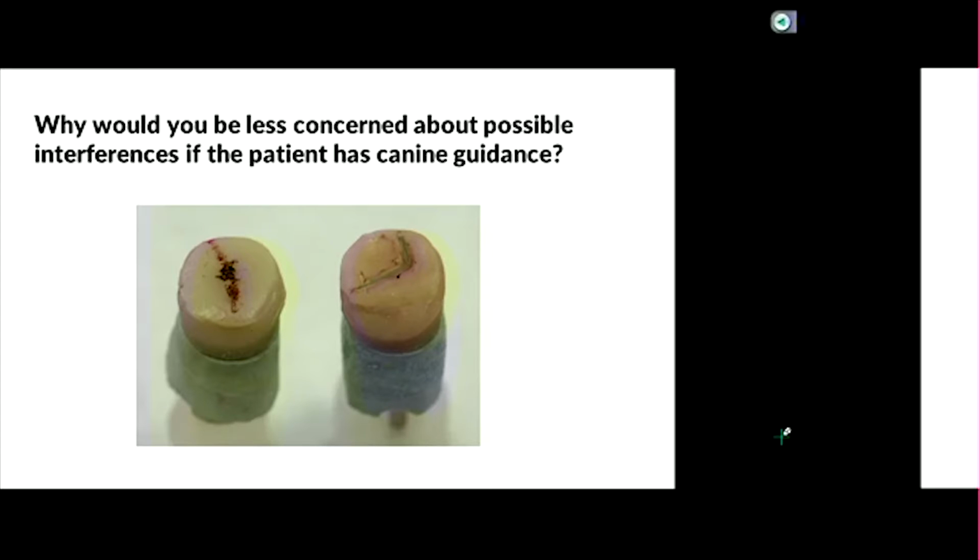Okay? So if you want to think of it the reverse way, let's say our patient's 30. On your articulator, you get everything mounted up, and then you mistakenly set the inclination to 60. So you're at 60 now. Now, when you move to the side or in protrusion, you've got a ton of space for clearance, right?